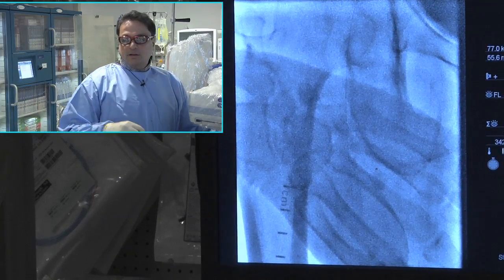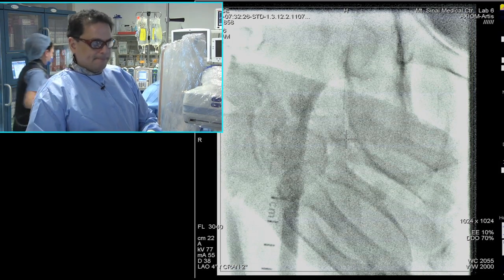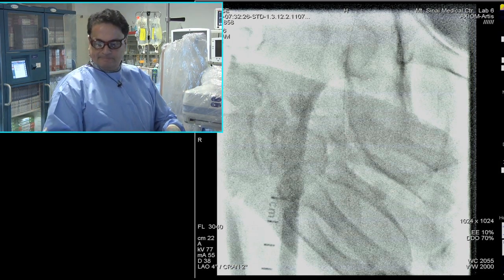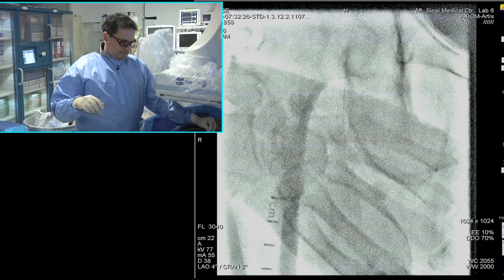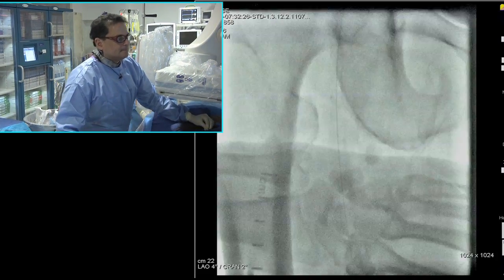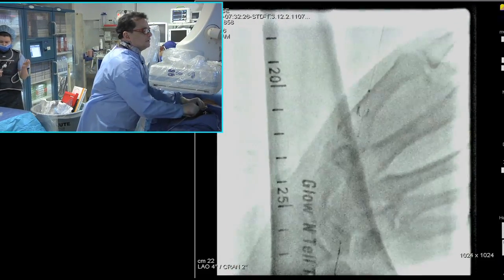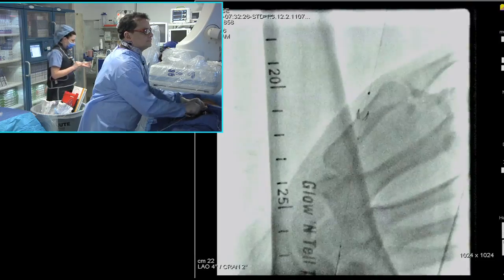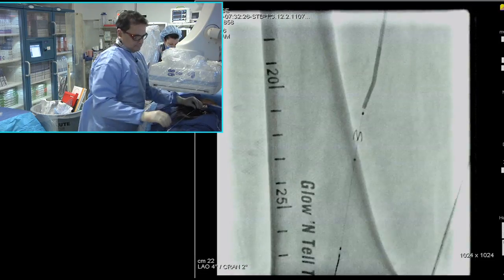I think it's very important for the viewers to always make sure to take regular pictures, especially when the patient is complaining of pain, just to rule out any perforation that might be adding to the whole clinical scenario. That's why you'll see PK take these pictures, especially after ballooning and after atherectomy, just to make sure, especially when the patient is complaining as well. I think that's an important point to consider while doing these procedures.